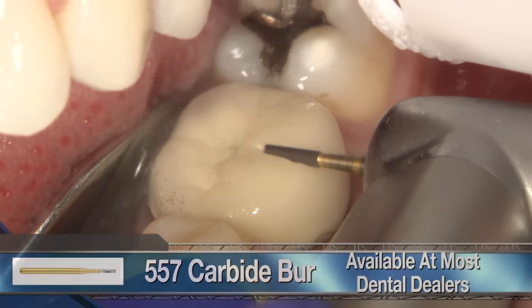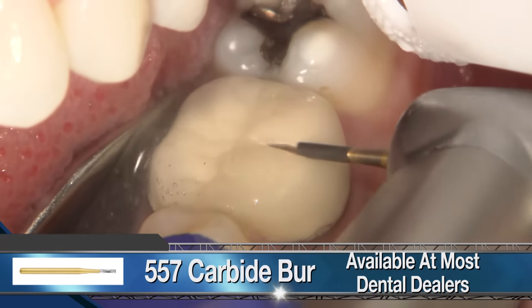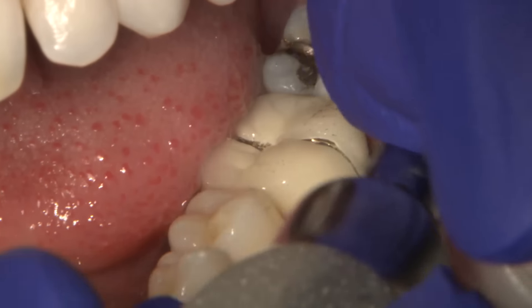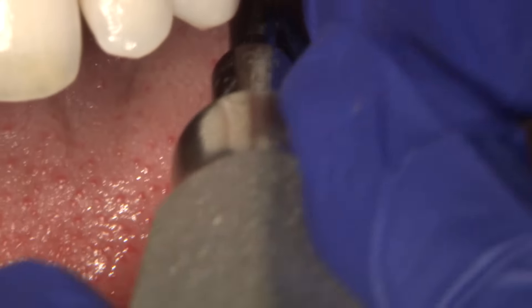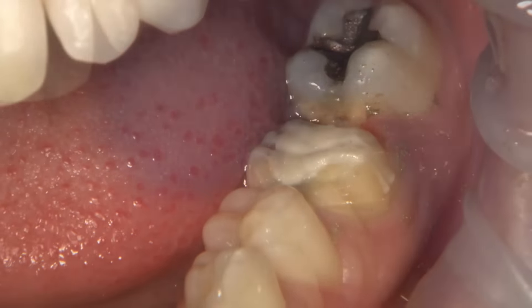We begin the removal of the old PFM by carefully cutting through the entire restoration until we reach the tooth structure beneath. Using a 557 carbide, I connect my depth cuts along the buccal and occlusal surface, ensuring I've cut entirely through the crown's metal substructure.